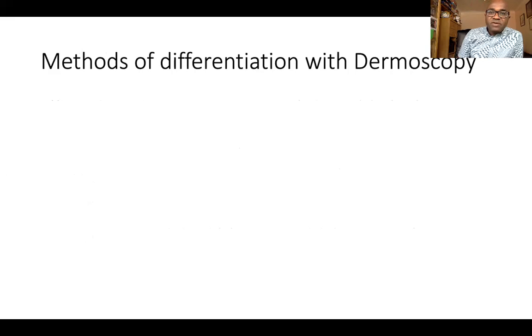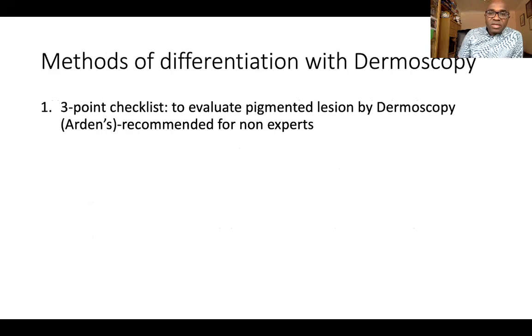The methods of differentiation will be the 3-point checklist to evaluate pigmented lesions by dermoscopy. For those of you GPs in West Sussex and East Herts area, you'll be concerned with Arden's template on System One, which has this 3-point checklist built into the dermatology aspect of that template.